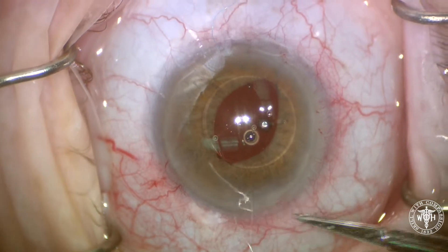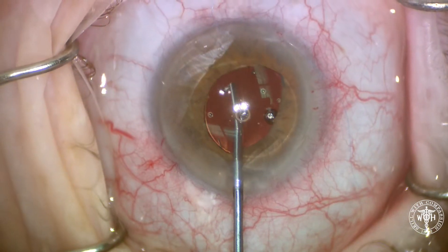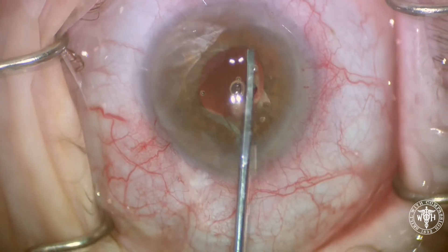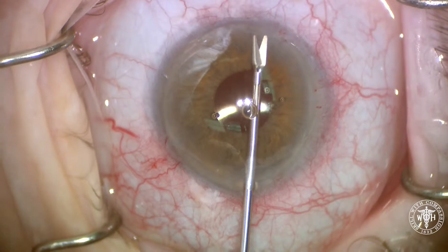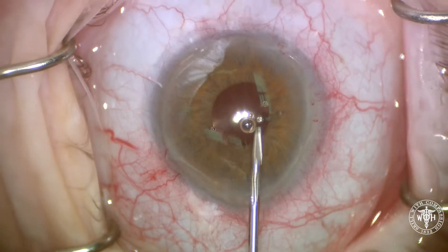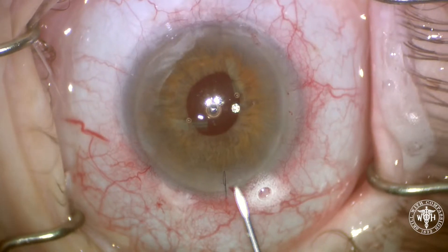We're going to cut the ends quite short using a scissor and then prolapse the optic back posterior to the iris. For the distal sutures, I'm going to use a micro scissor to help cut the 10-0 prolene, and then the two ends can be removed from the eye.